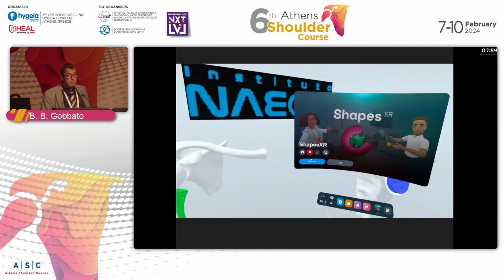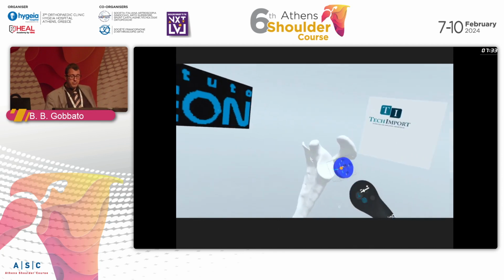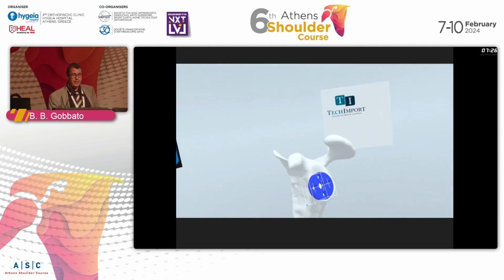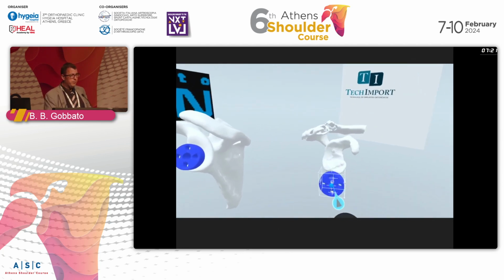And the ability to plan it manually gives you the option to do whatever you want with that planning. For example, from Exactech software and from Blueprint software, you are pretty much stuck in that software, you cannot export anything. So if you want to use even mixed reality, if you want to use VR, this is a VR planning. If you want to use your iPhone during the surgery, I don't know. Sorry, you will still have to plan a little bit manually because we cannot export your planning from these company softwares.